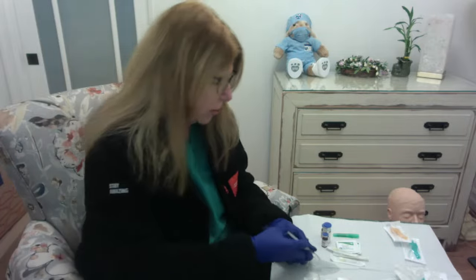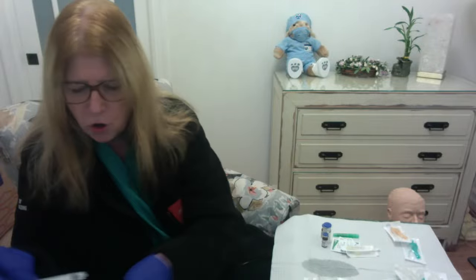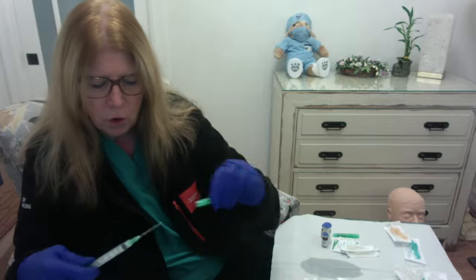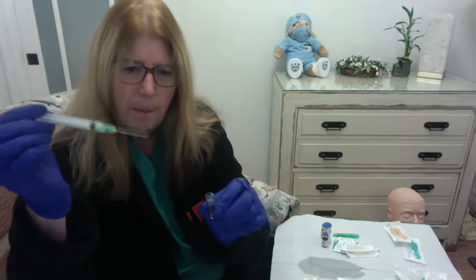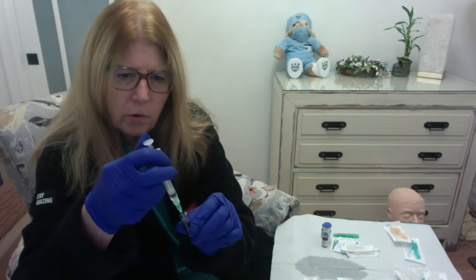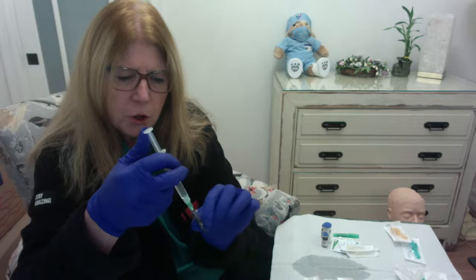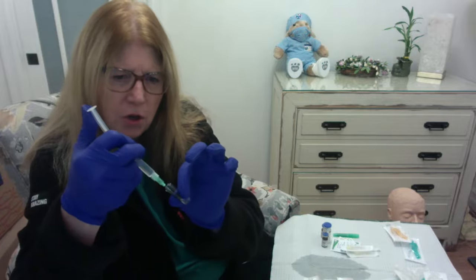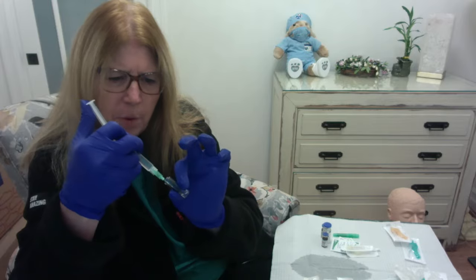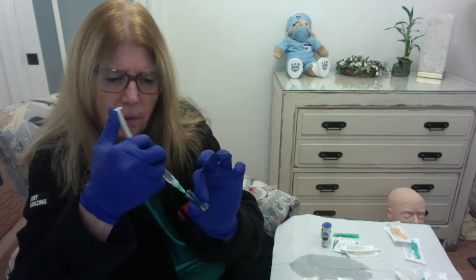So let me just, I have a waterproof surface here, so let me just show you once again drawing up out of the ampule. So the needle goes in, right, and we use thumb, whatever you're comfortable with, to pull that plunger up to get that medication out of the ampule, and bevel down so that you can suck up everything.